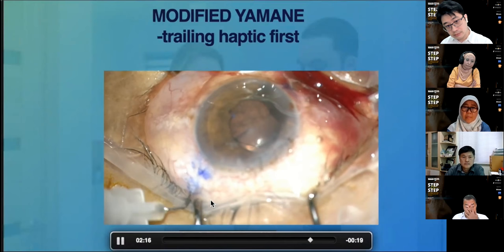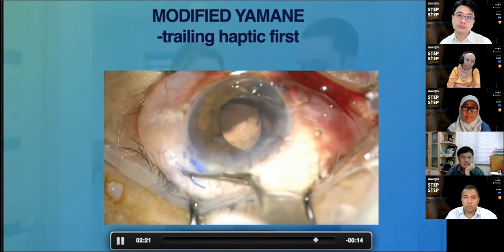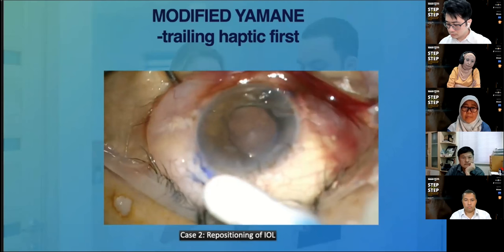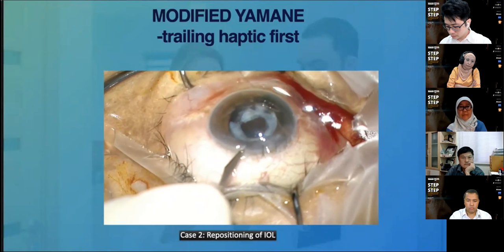So I suppose it is a nice alternative technique, especially if you end up having this kind of cases. I love this technique in this particular case, and I'm glad I did it so I don't have to expand the lens and create another bigger wound.